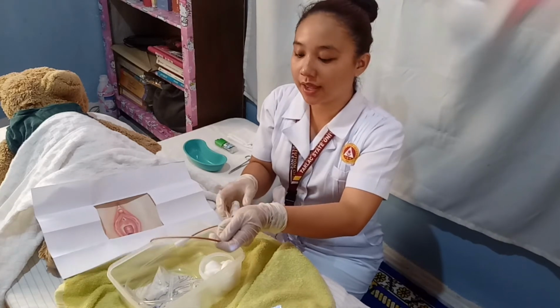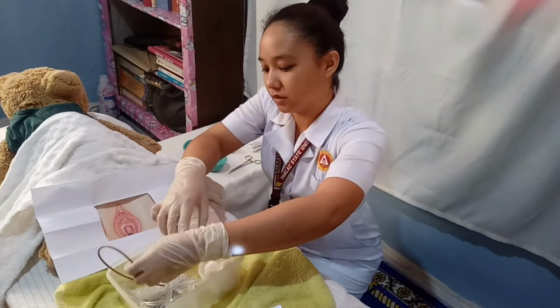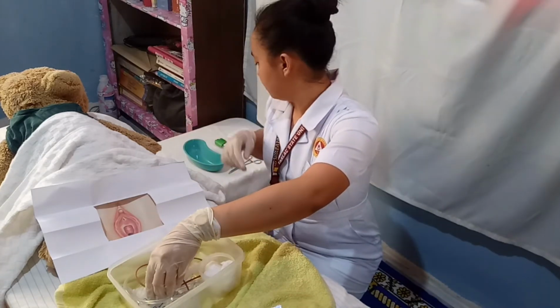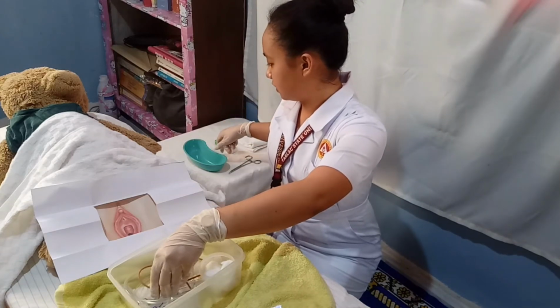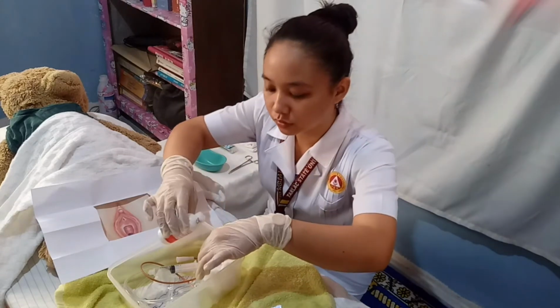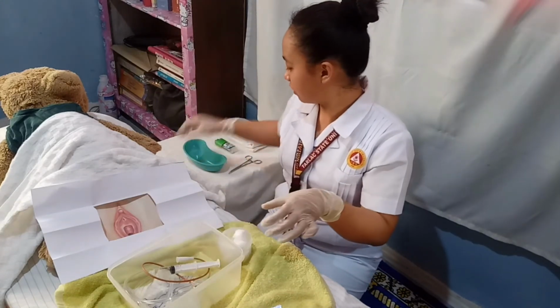If you need to pour an antiseptic solution over the cotton balls, for instance, let's say this is the antiseptic solution, and we have these cotton balls.